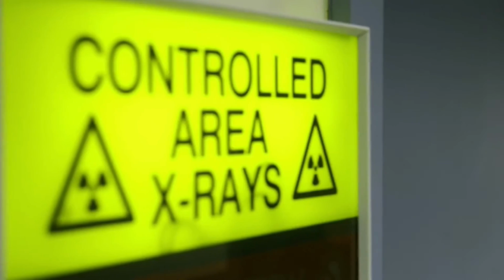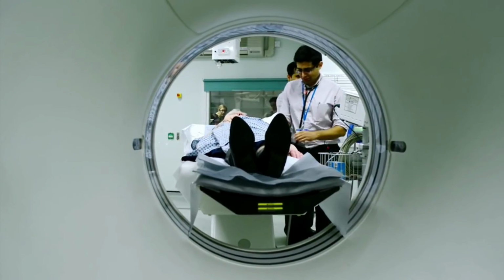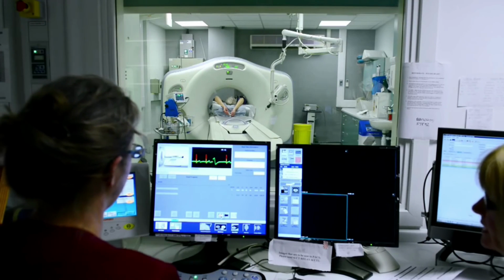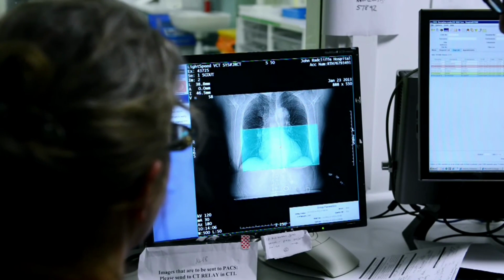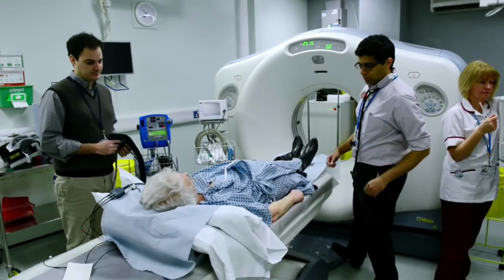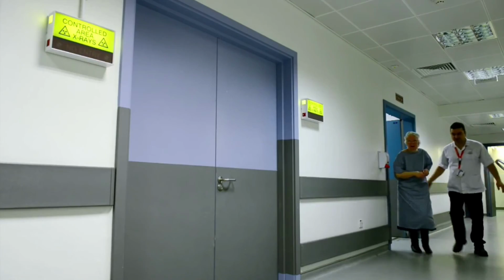My name's Chirag Shivadarya and I'm an honorary consultant cardiologist at the John Radcliffe Hospital in Oxford. A CT angiogram is a relatively new technique that allows us to look at the coronary arteries. The conventional way that we assess a patient for coronary heart disease is with a diagnostic angiogram that's more invasive for the patient. A CT scan is a special form of X-ray that involves radiation, and it enables us to take pictures of the coronary arteries. And from those pictures, we can work out whether or not the patient has narrowings in the coronary arteries that may be causing their symptoms and may be important to their health.